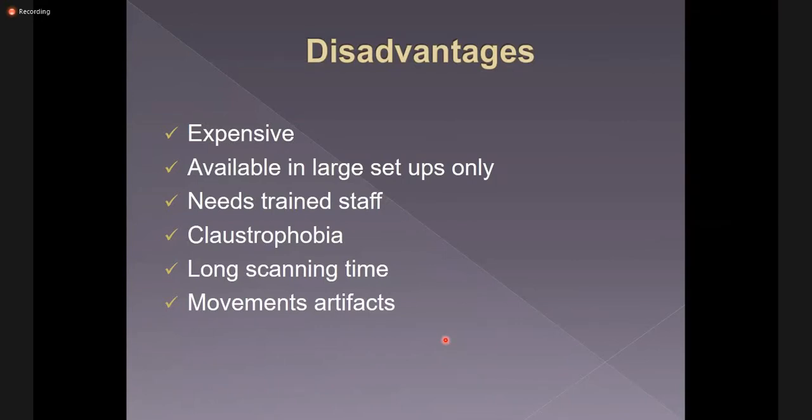Disadvantages: it is very expensive, and it is available only in large setups because it needs trained staff. Not every setup has it. There may be claustrophobia because the patient has to lie in a small tunnel, and there is a ringing noise from the magnet.